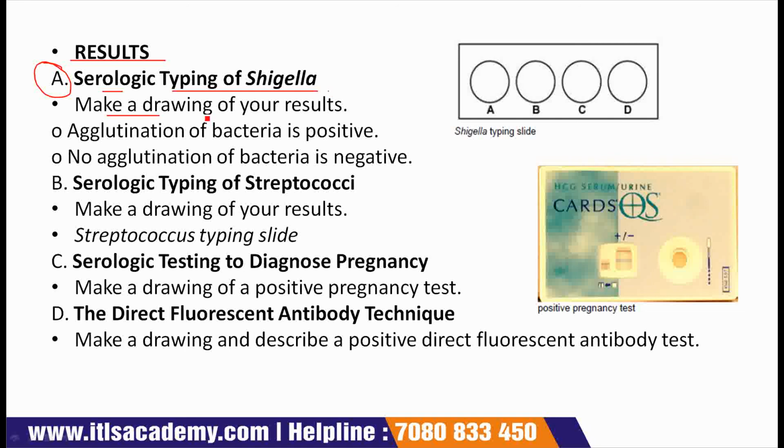Make a drawing of your result. In these results, agglutination of bacteria is positive while no agglutination of bacteria is negative. This is Shigella typing slides.